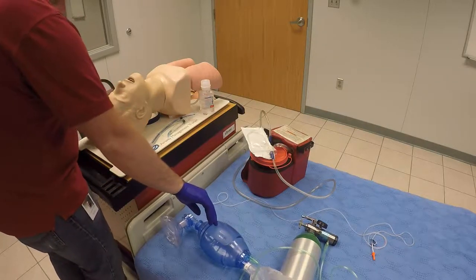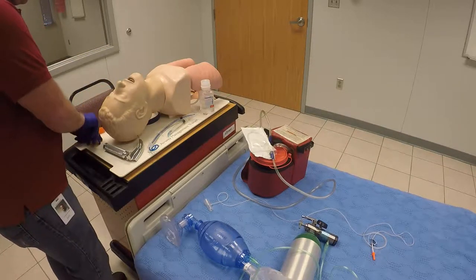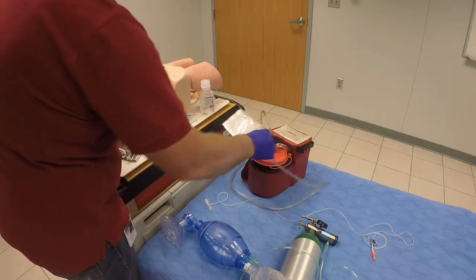I do have proper airway adjuncts here. I've got an OPA, properly sized from the corner of the mouth down to the earlobe. I've got my suction unit here — portable suction with flexible catheter — in case we need that.